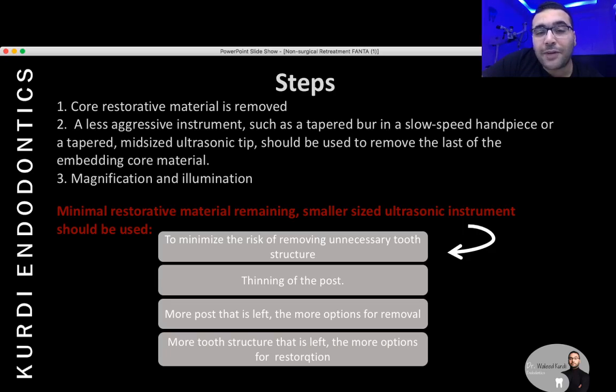I'm so sorry, I'm a little bit tired today, and anyhow, I just lost my way. Anyhow, all right. Magnification and illumination indeed will help us to make a good treatment and a good way to remove this post.